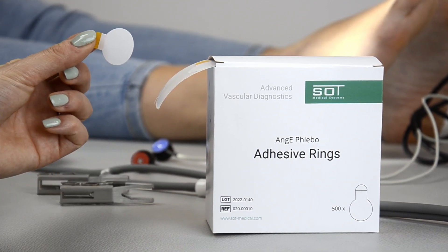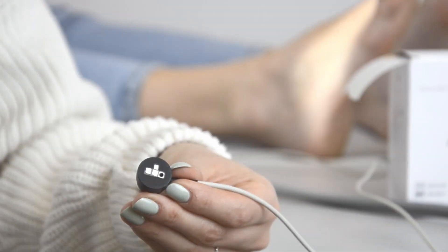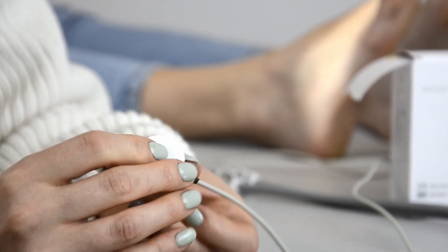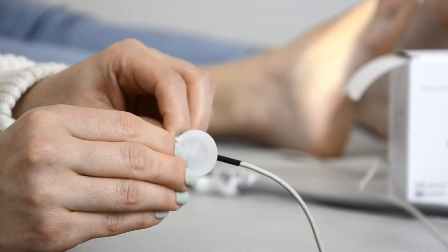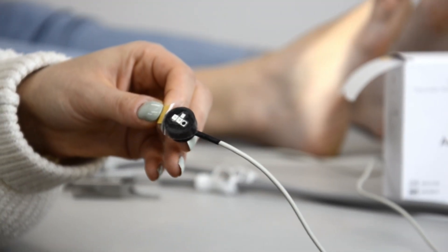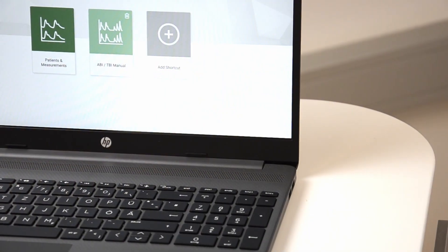To apply the double sided adhesive rings, take one ring off of the roll and apply it to the sensor firmly. Peel off the protective layer. The adhesive rings are for one time use only and have to be removed after the measurement.